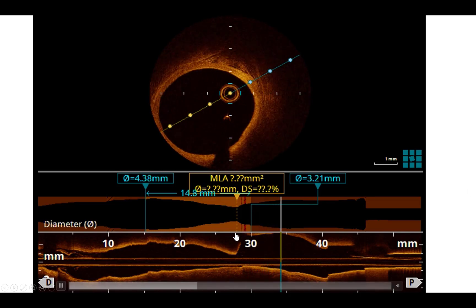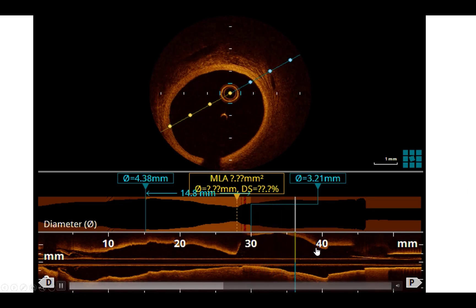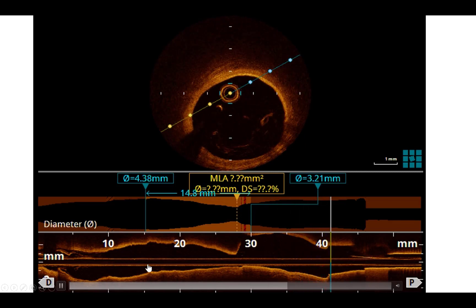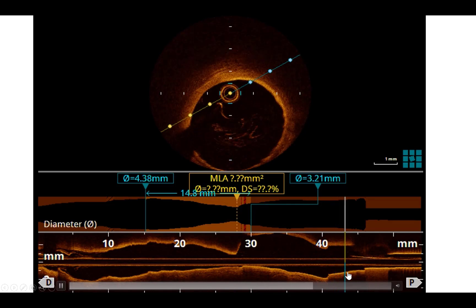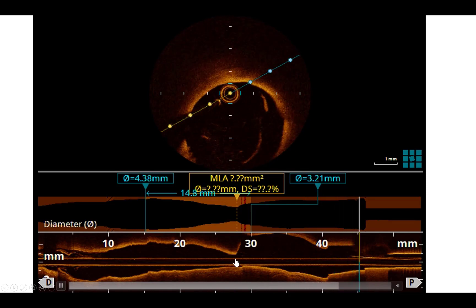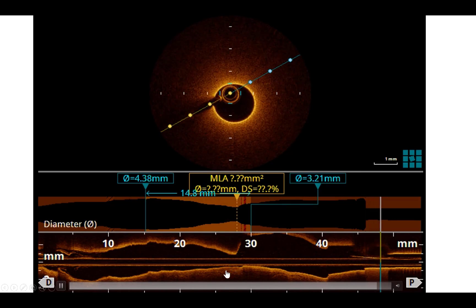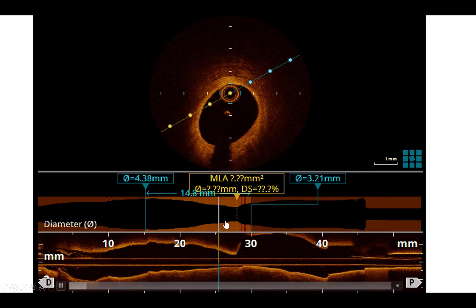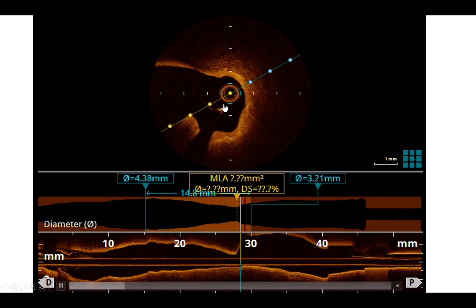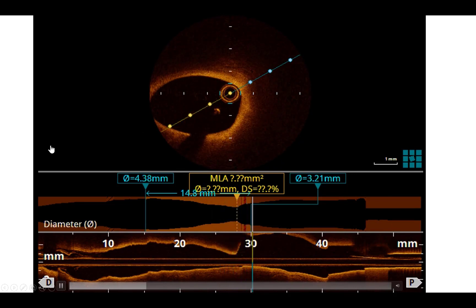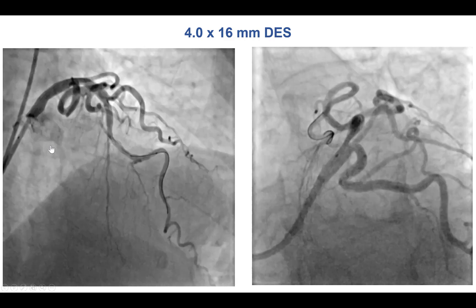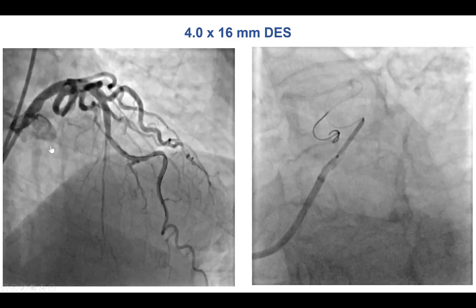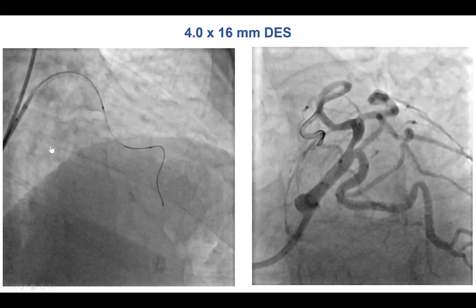As a result, we decided to do imaging, and OCT is the preferred modality because it can potentially identify thrombus. OCT was indeed performed. It did not demonstrate any intracoronary thrombus, neither in the middle LAD nor in the left main and the proximal LAD. However, there was a significant lesion in the proximal LAD, although assessment by OCT is challenging for assessing significance of stenosis. Nevertheless, this was the only lesion found and the patient had typical symptoms, so it was decided to proceed with percutaneous coronary intervention.